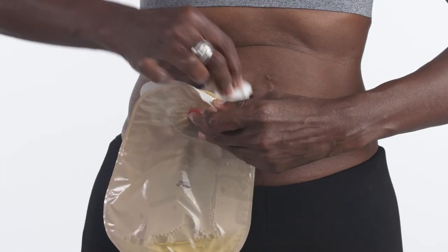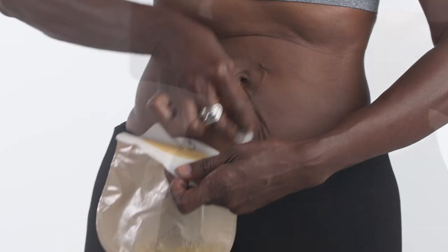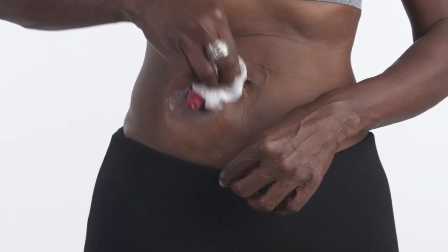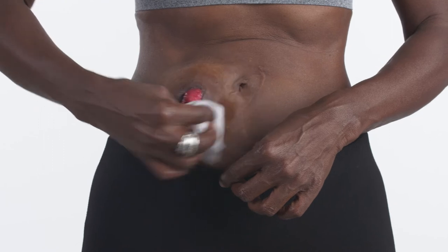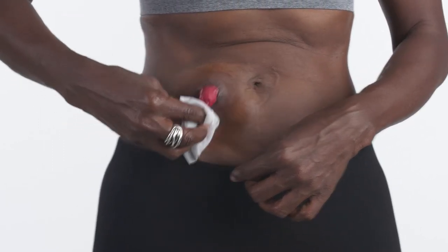Wash the skin thoroughly with water and pat dry. To prepare for applying a new pouching system, use a protective barrier wipe or spray to create a protective film on the skin. Simply spray or pat a barrier wipe around the area and let it dry thoroughly.